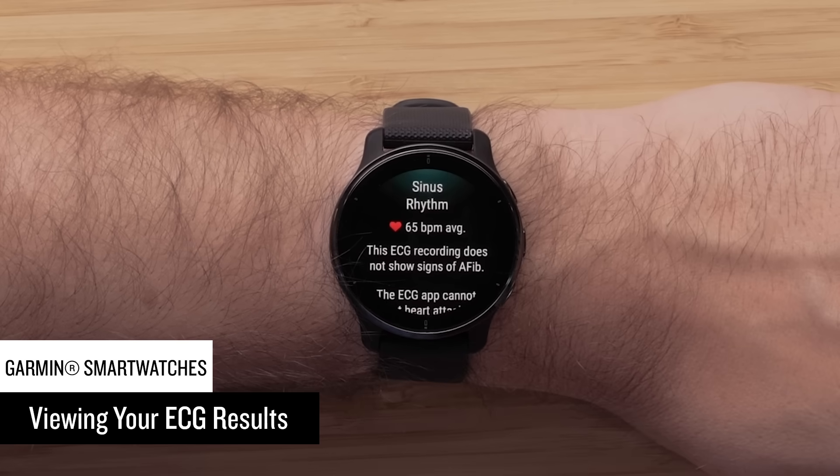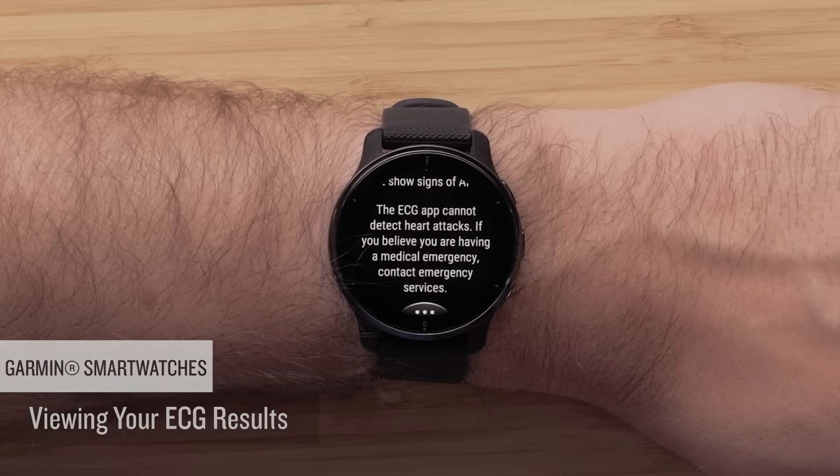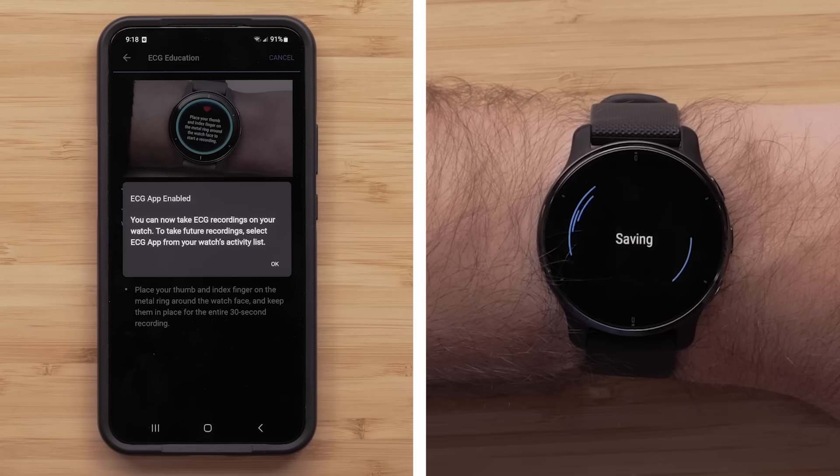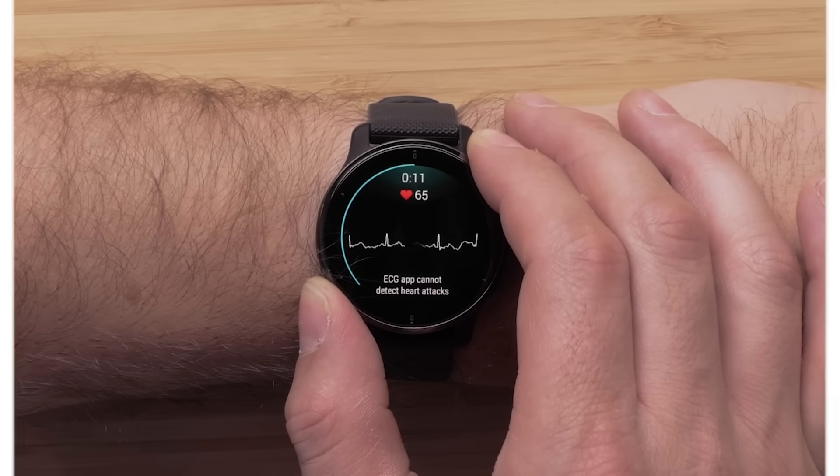After the recording is finished, you'll see your result in the ECG app on your smartwatch. And that's all there is to it. For more help, please visit support.garmin.com.